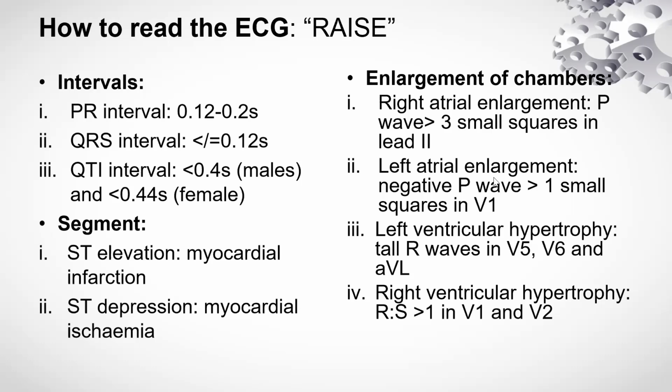Then S, you look at the segments, the different segments. What we're looking at is the ST segment. Is the ST segment elevated, like you will see in STEMI, myocardial infarction, or is the ST segment depressed, as you will see in myocardial ischemia?